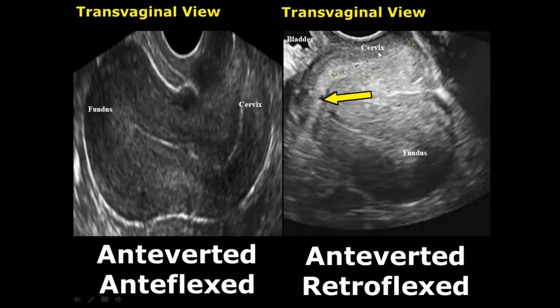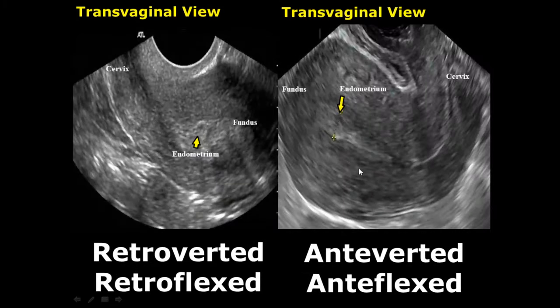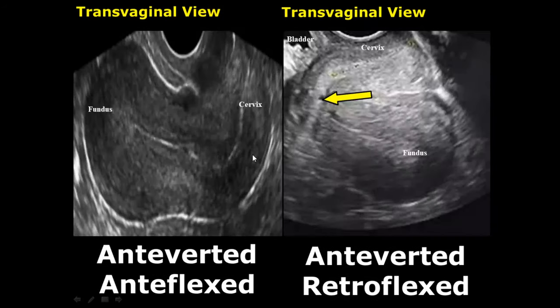In the anteverted and retroflexed uterus, the cervix is again facing upward anteriorly, and the body of the uterus is bending away from the bladder, that is posteriorly. You can see the bladder in the top left corner of the image. Another feature is that in retroflexed, the fundus or the body will appear on the right side of the image.